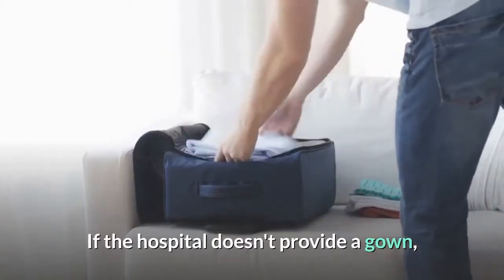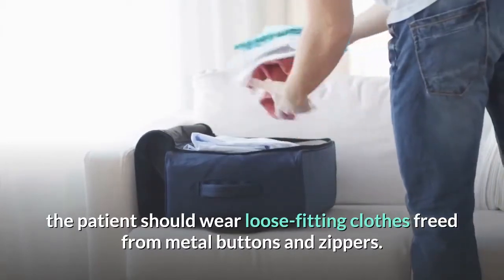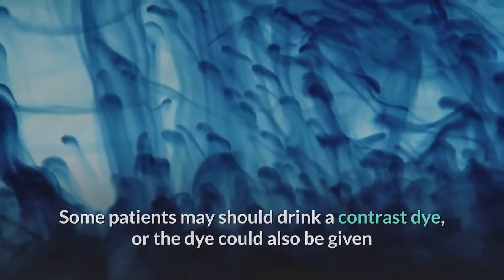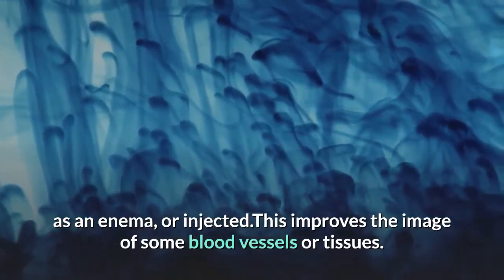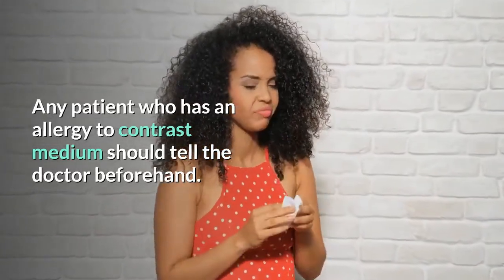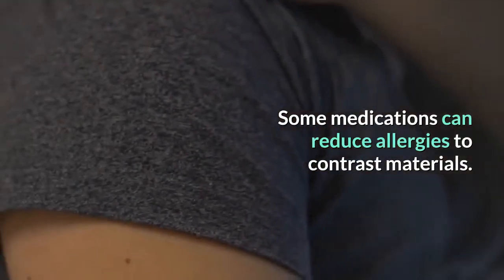If the hospital doesn't provide a gown, the patient should wear loose-fitting clothes free of metal buttons and zippers. Some patients should drink a contrast dye, or the dye could also be given as an enema, or injected. This improves the image of some blood vessels or tissues. Any patient who has an allergy to contrast medium should tell the doctor beforehand. Some medications can reduce allergies to contrast materials.